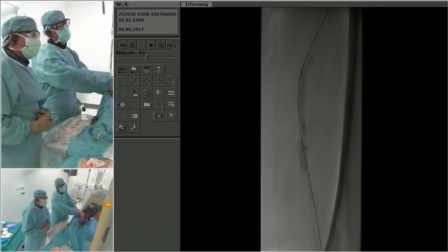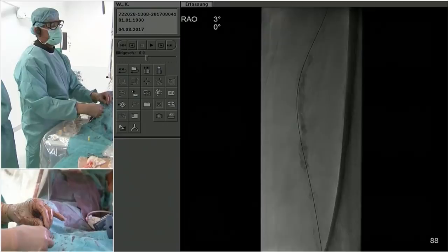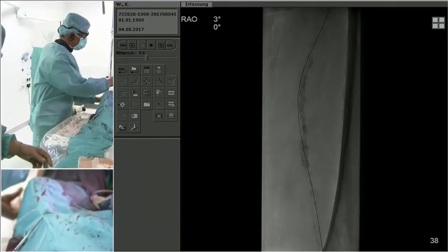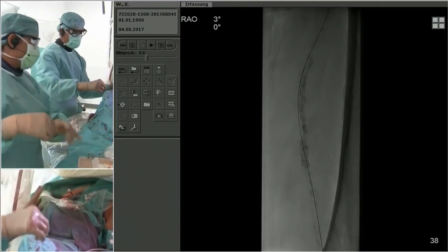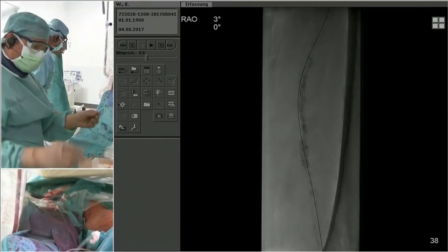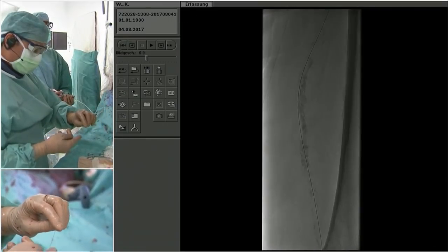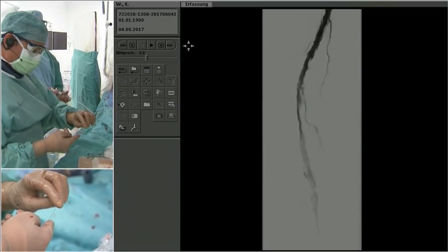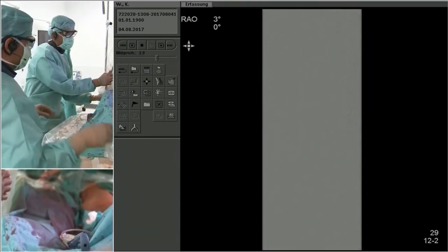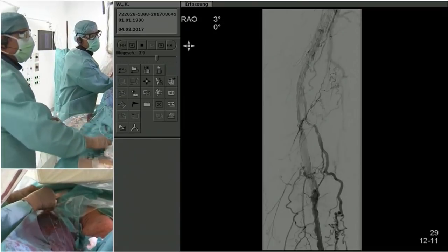Good points. Mehdi, Khusrow, and Christian. So, relining the Viabahn with a Supera stent is not a highly prevalent technique. So, how many of you actually practice it, and when do you think that is a reasonable approach? I think folks have used it in the setting of popliteal artery aneurysm, to give the Viabahn the support across the knee, as John was mentioning, across the knee with Viabahn, sometimes you can get kinking. I think this situation is interesting. I am interested in Andrej's take on this. Since he's so subintimal, it seems like most of the calcium is on one side, and actually the balloon's dilated pretty nicely. Andrej, what are your thoughts about that?